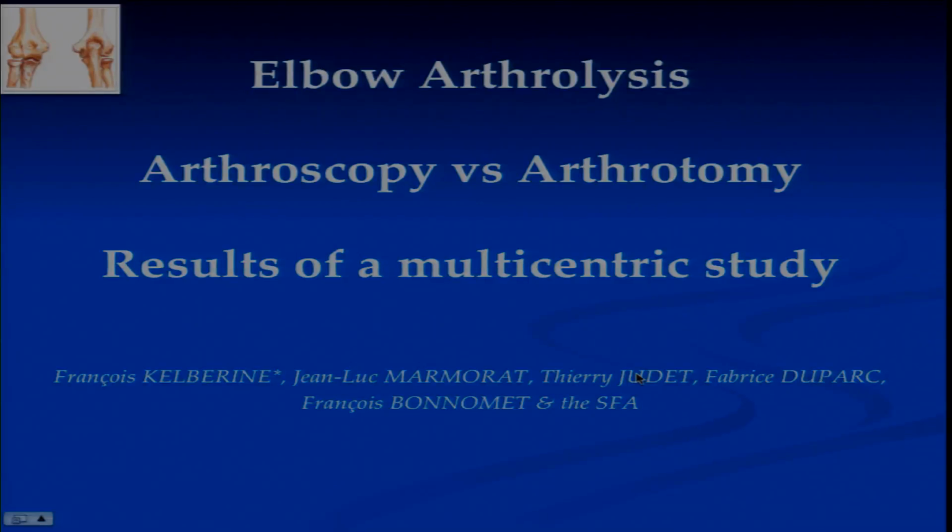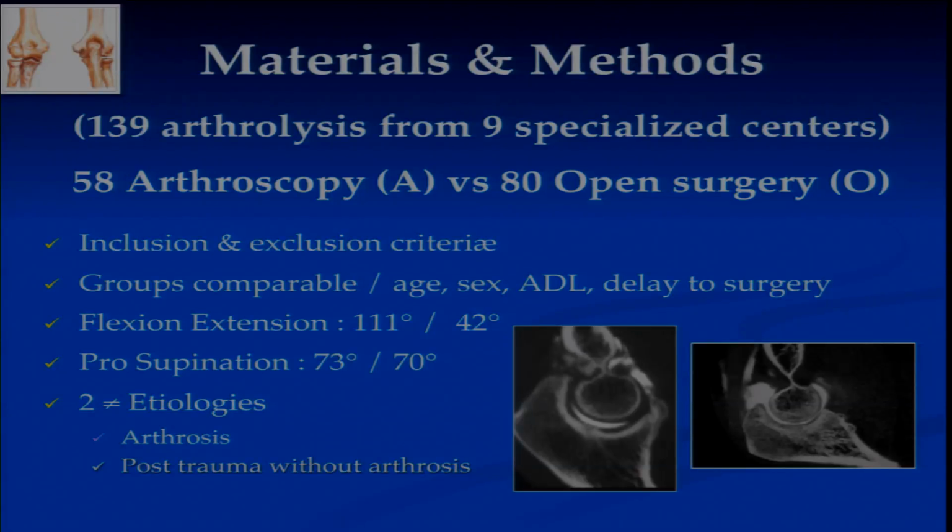We performed with the French Arthroscopy Society a study comparing two populations: open arthrolysis in special centers and arthroscopic arthrolysis in specialized centers. Of course, the inclusion and exclusion criteria were very strict to find two groups comparable. They were quite comparable regarding the mobility, the age, the sex, the activity of daily living. There was only one thing which differed in both cases.